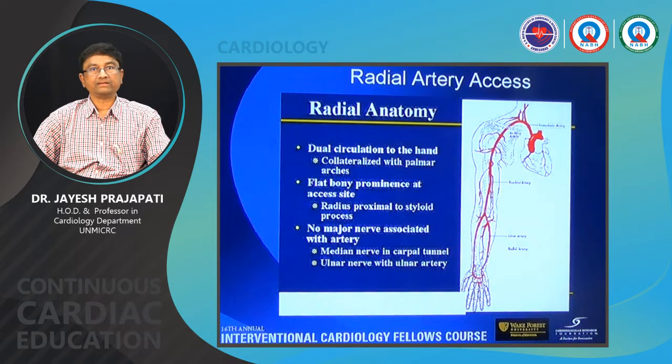And the radial we have to puncture over the styloid process. There is a bony support, and that is a radial advantage. What is the advantage of radial? Of course, one thing is you can compress it very easily.